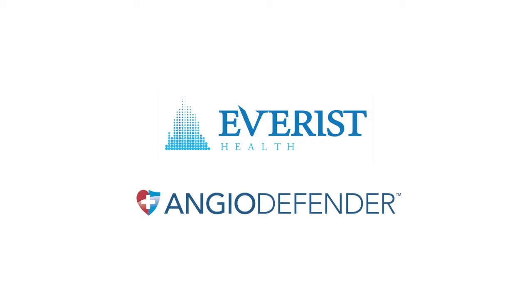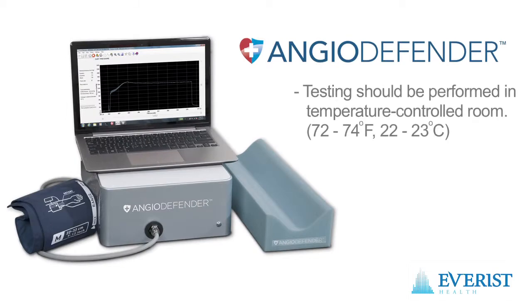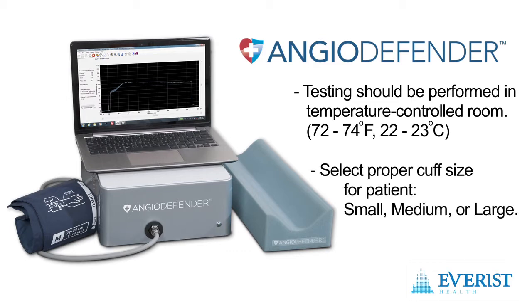This video steps us through the basic operation of the Angio Defender system. Angio Defender testing should be performed in a warm, temperature-controlled room. To perform testing, a properly sized cuff is first selected for the patient's arm.